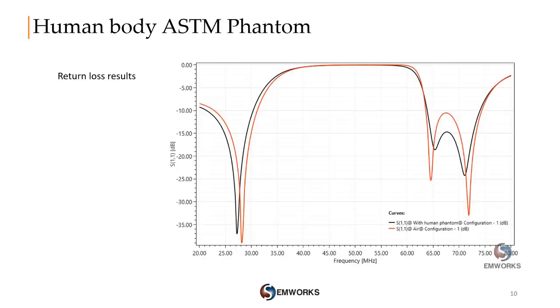The first results are for the case of a human phantom without adding the implant inside it. The return loss curve versus frequency of the studied MRI with and without a human phantom is shown in the next figure. The red curve is for the MRI return loss in free space, and the black one is when adding the human phantom. A slight shift is noticed with the same resonance frequency.